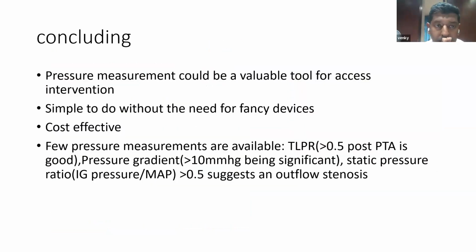To conclude, pressure monitoring could be a valuable tool. So you need not have any fancy devices. It's very, very cost-effective, with not much of a learning curve.